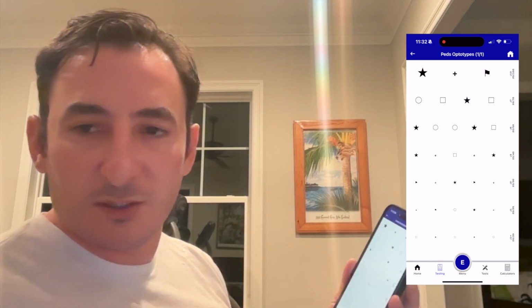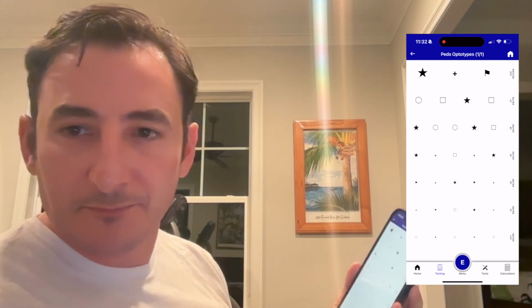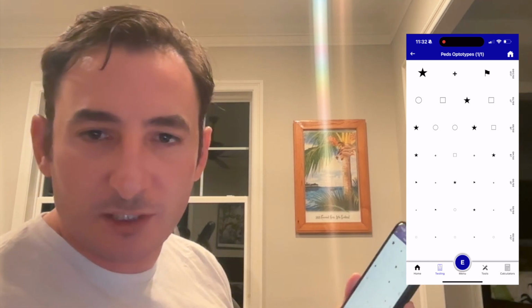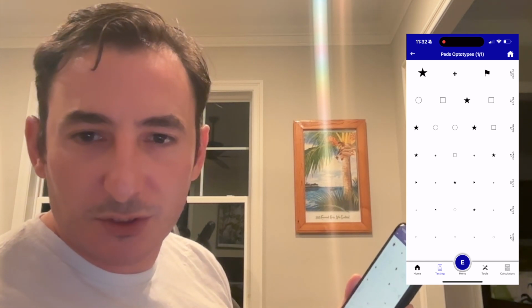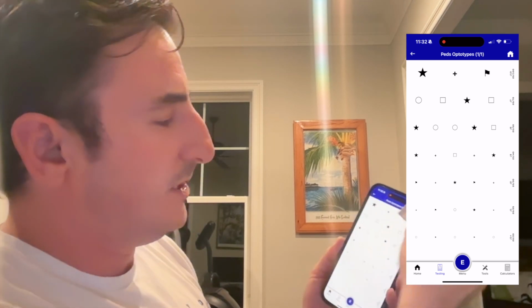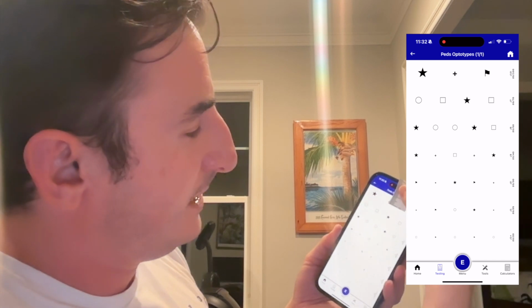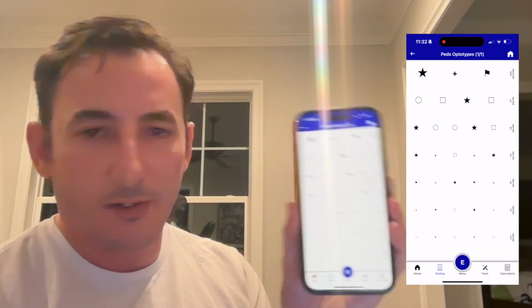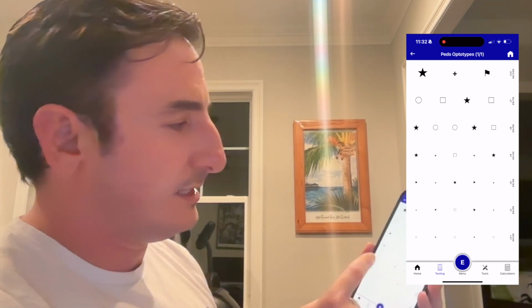And again, 5 millimeters if you look at the chart at a distance of about 14 inches should be about 20/200, not 20/100. But if you look at the plus symbol, it's about 3 millimeters. So just within the same row, there's not a consistency there.